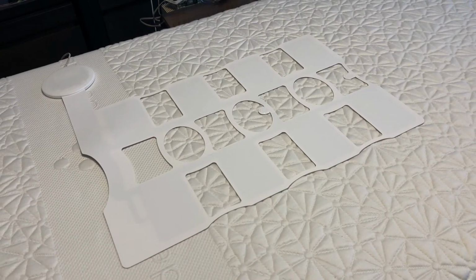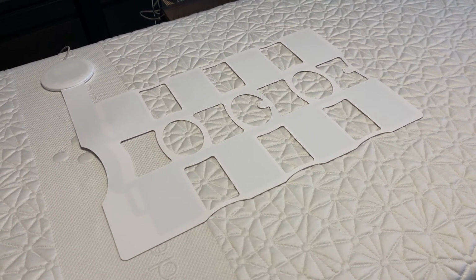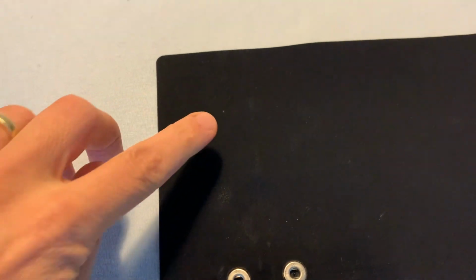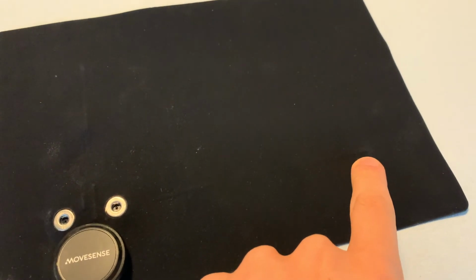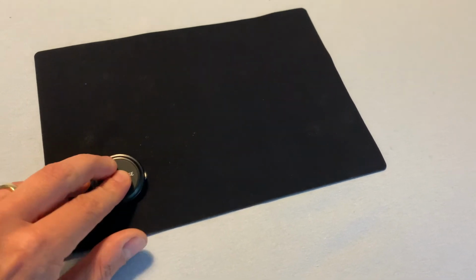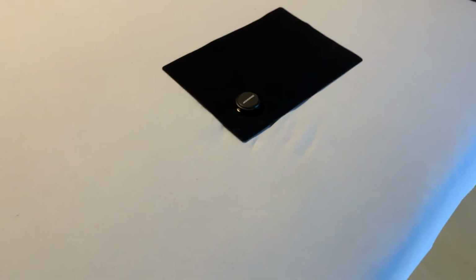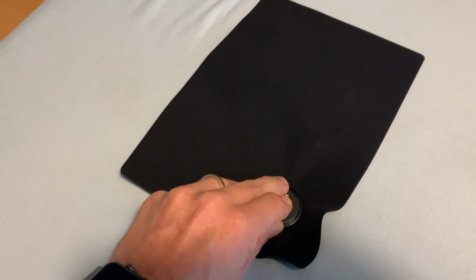We will show you now a couple of use cases that we have thought about, how you can actually get the data from the Movesense and combine it with it. We now take external temperature. Here we have a pad where each pad has two external one-wire temperature sensors that we combine with the Movesense sensor. We click them in. Now that system is ready to work, and the next one we do the same thing as well. So we put one in the head area and the other one in the area of the legs.